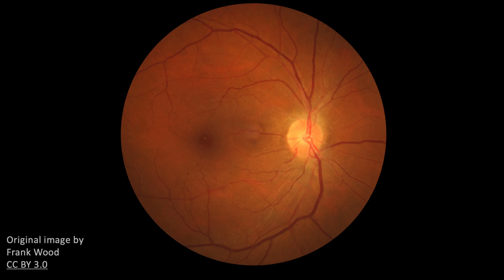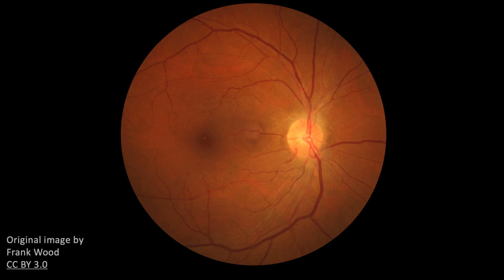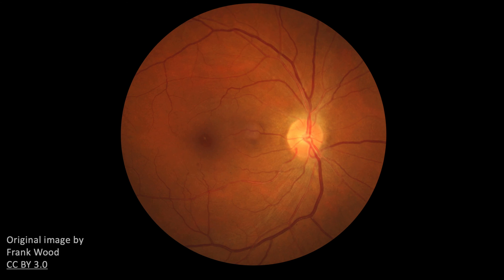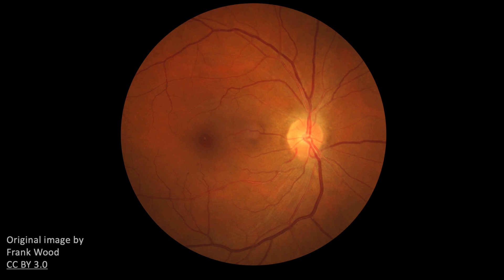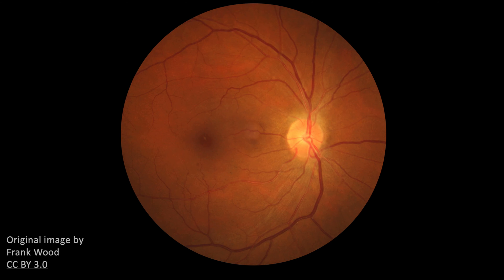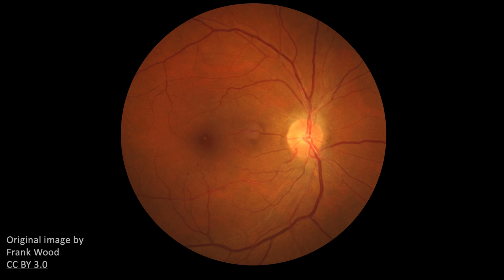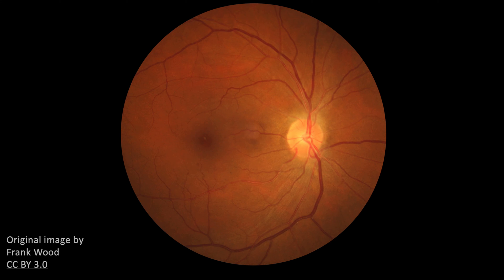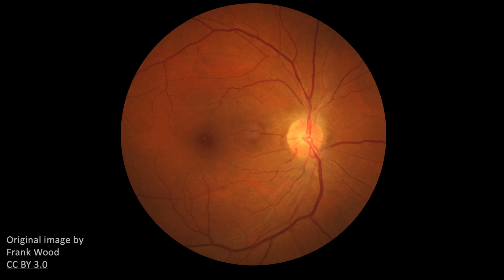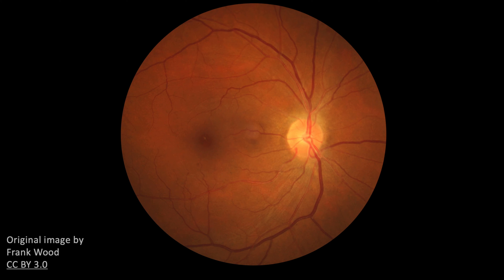With long-standing hypertension, the retinal arteries narrow and the vessel walls thicken. A characteristic sign of hypertensive retinopathy is arteriovenous nicking — that is, venous compression occurs at arteriovenous crossings. Higher grades of hypertensive retinopathy can result in retinal edema, hard exudates, hemorrhages, and cotton wool spots. Papilledema is a sign of severe hypertensive retinopathy.